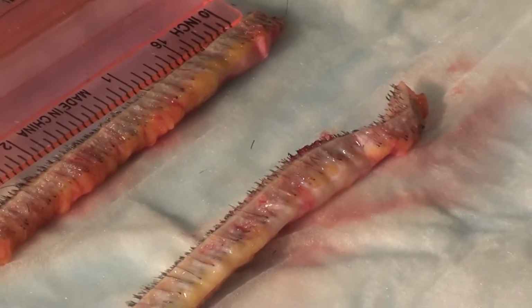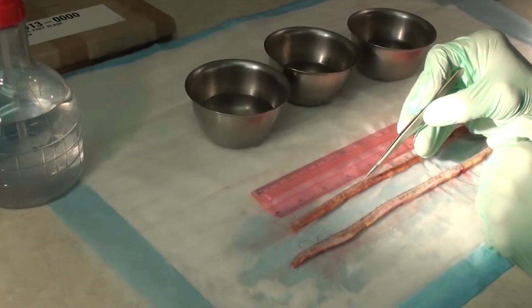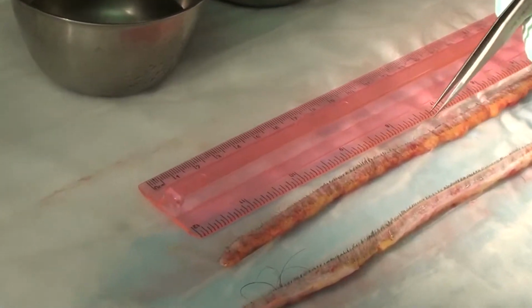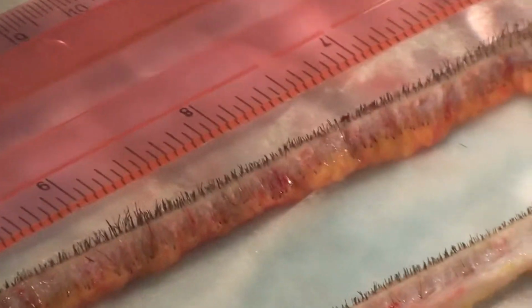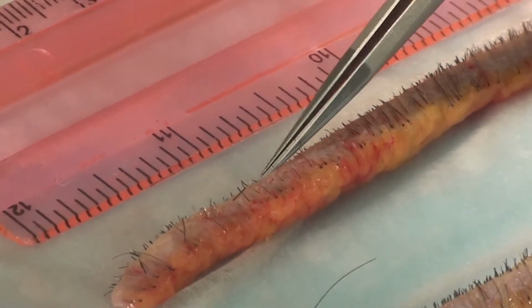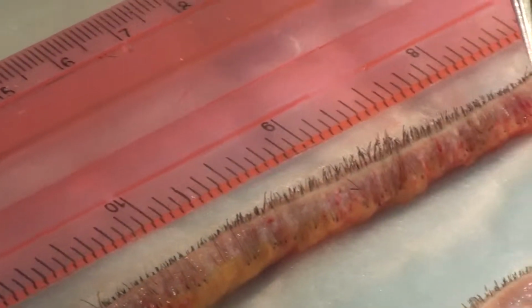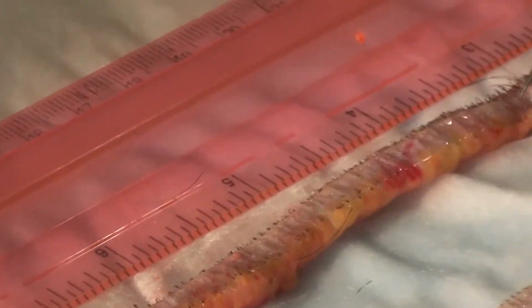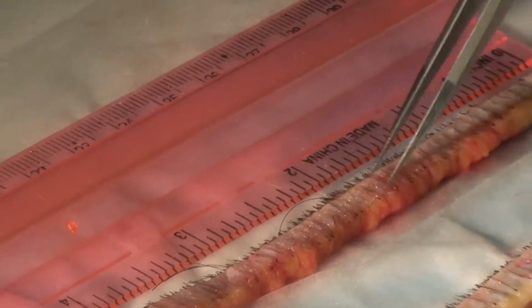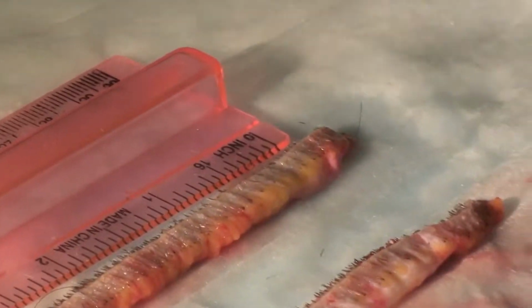which is absolutely terrific. Now you can take a look at this other strip here. It looks nice and clean. Same thing, we're just always checking for any transection. And you can see everything looks nice and clean. No transection the whole way throughout. Everything looks just perfect. So we got a really perfect yield. And you can just kind of follow it yourself, and you can see the bulb of the follicle is the little dots, and then that's the hair follicle, and then that's where it comes out. So you can see the top where it comes out. So the strips are just beautiful. We got a really beautiful harvest, which means we're going to be able to get a lot of hair for our patient. You can see it's nice and intact the entire way. There's virtually no transection on either of the strips, which means we're just going to get a lot of hair.